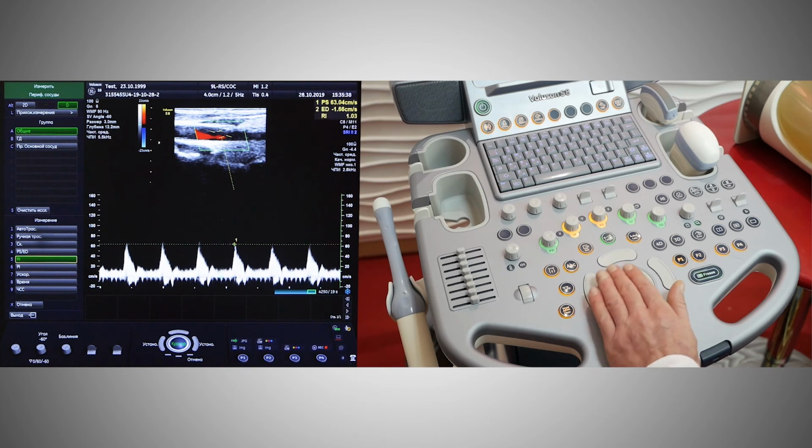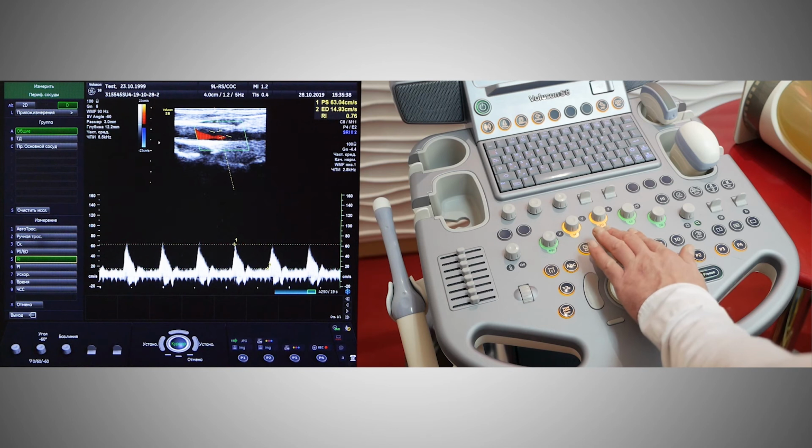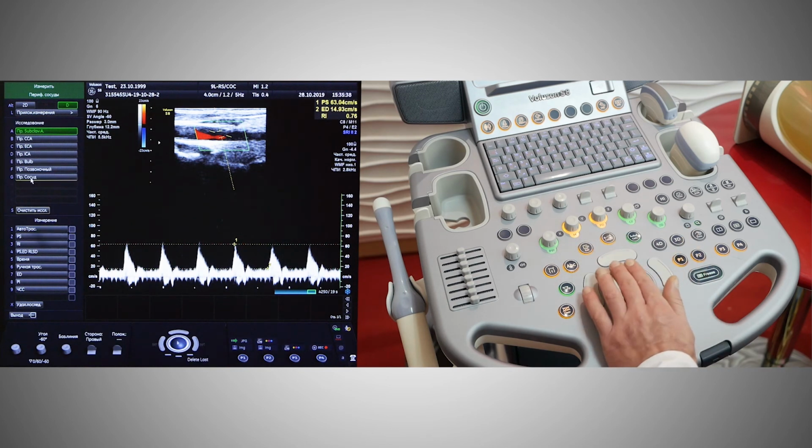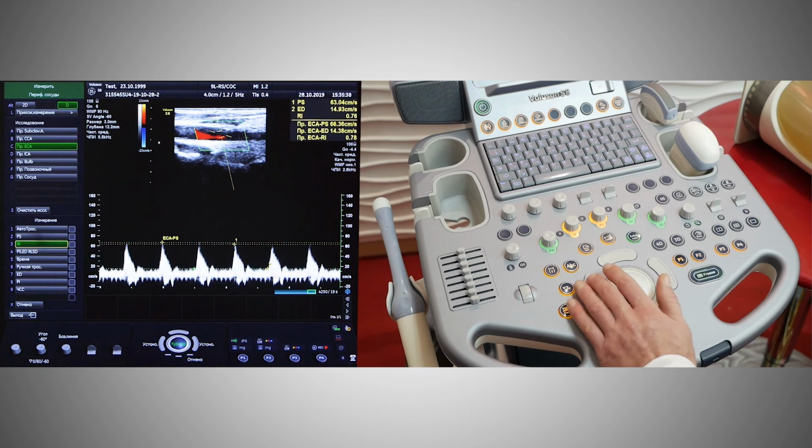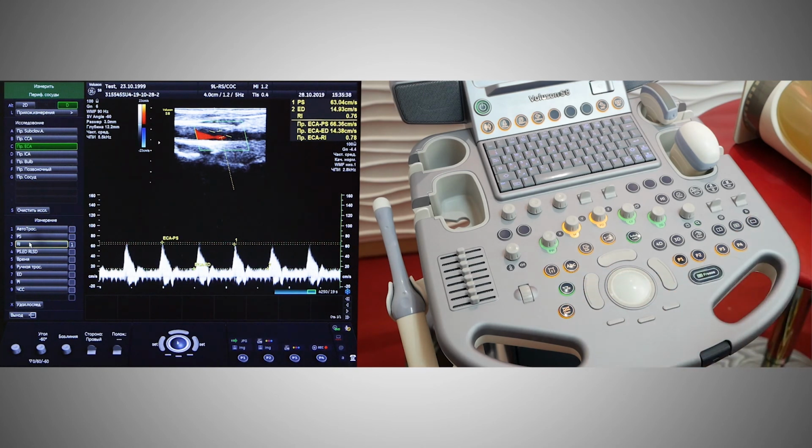If we set peak systolic and end diastolic velocity, we will get a resistive index. And also complex measurements. That means we choose the vessel that we are examining. For example, we measure, for example, in this case, the resistance index. And we will get the resistance index again.